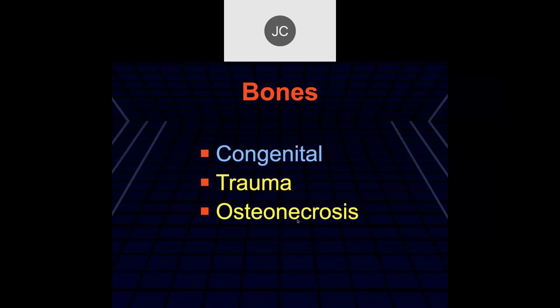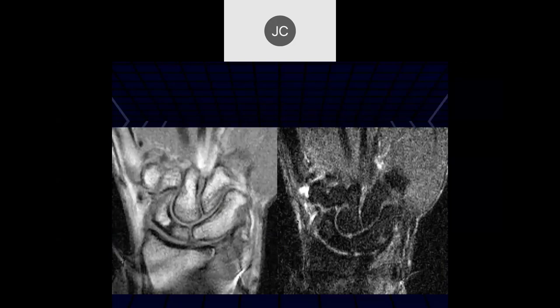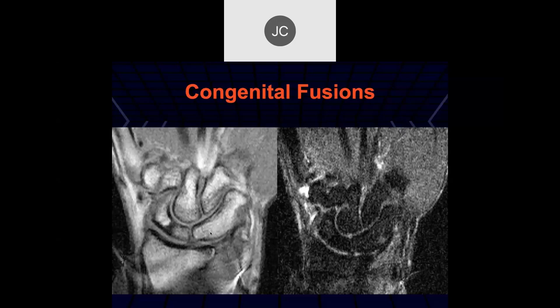Let's talk about bones. Looking at the lunate and triquetrum, they look like they're fused. Here you have a fusion between the scaphoid and the lunate, and a very elongated triquetrum, with a single joint involving the proximal carpal row. This is congenital fusion. Congenital fusions are not rare in the wrist, especially in kids.